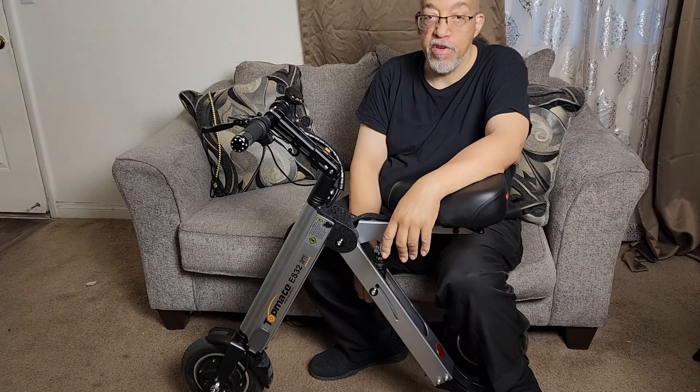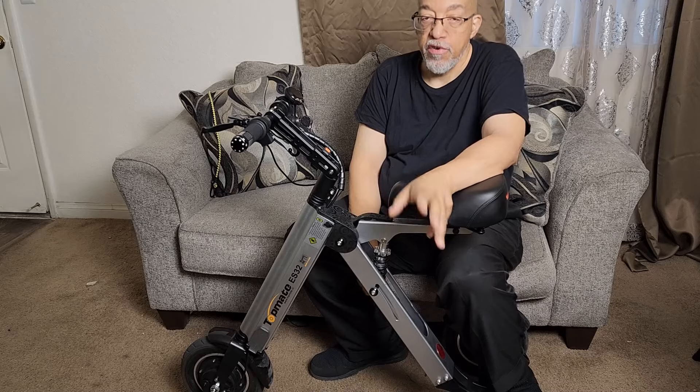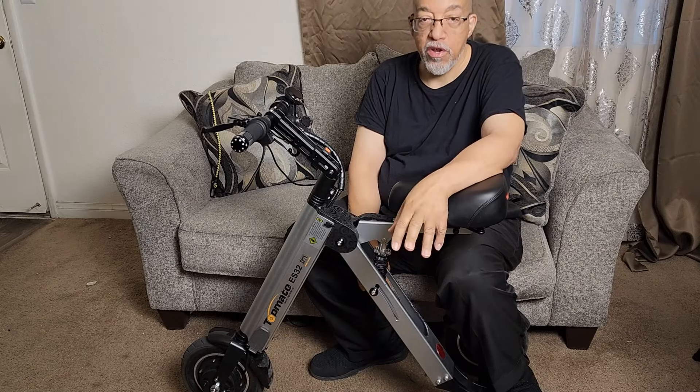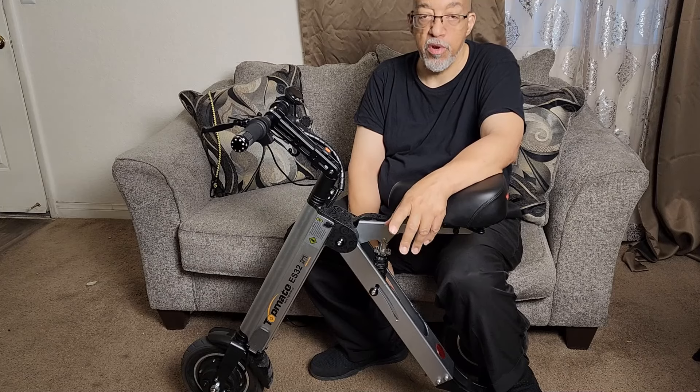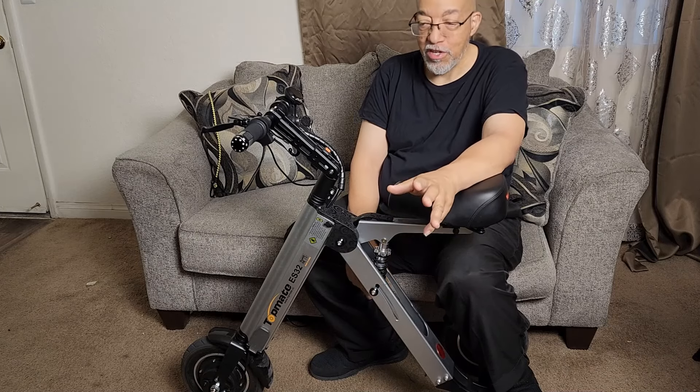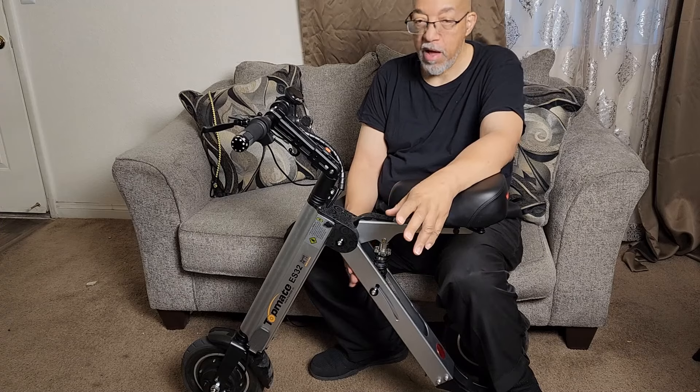It's a very smooth ride. It gets me where I need to go and back. I ride it on the bus and it's easy to put on the bus — sometimes they even lower the bus so I can roll it on, but I don't need to because it's pretty light, like 35 pounds or so.